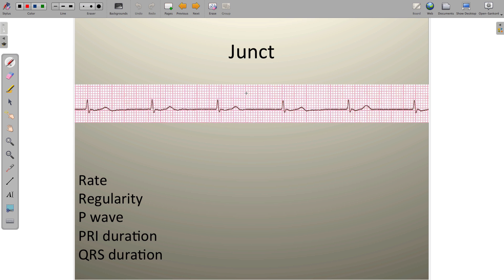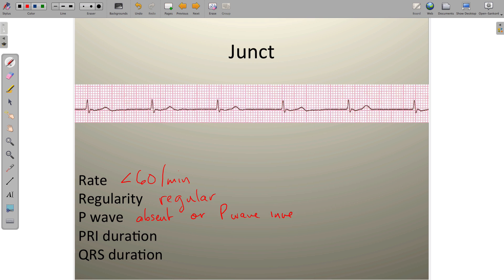Junctional rhythm is characterized by a rate less than 60 beats per minute and is extremely regular. With the P wave, one of two things will happen: it will either be absent, or it will be inverted — an upside-down P wave that may precede the QRS complex. If there are no P waves, the PR interval is not measurable; if an inverted P wave precedes the QRS, the PR interval tends to be short, less than 120 milliseconds.